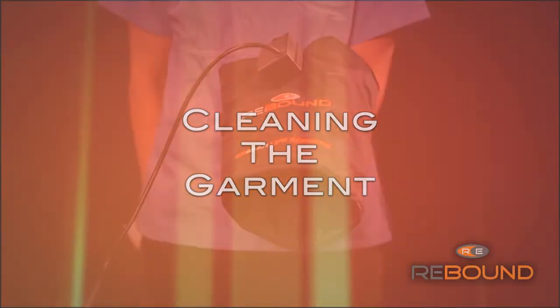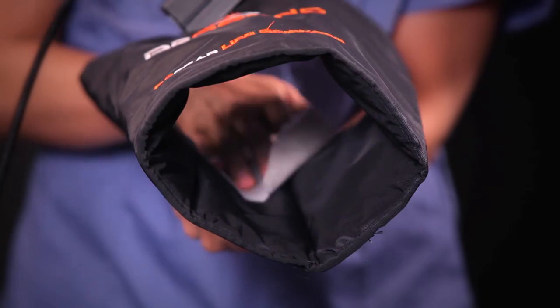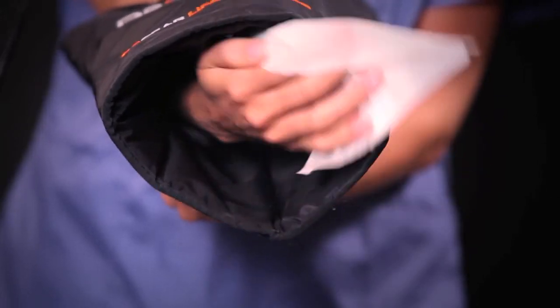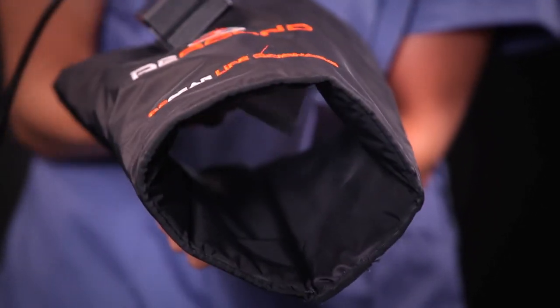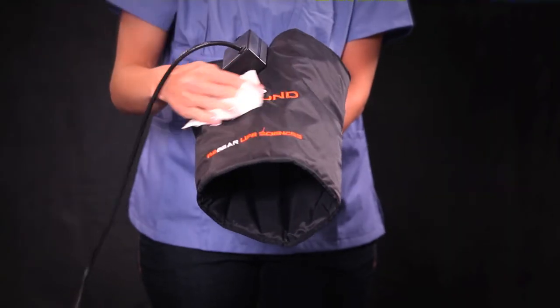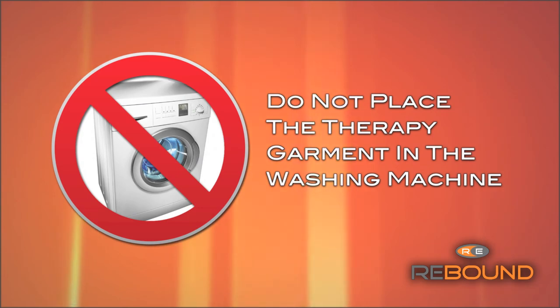Cleaning the garments — it is recommended to clean the therapy garments in between uses. Simply wipe down with an antibacterial wipe or spray. Additionally, the fabric contains an antimicrobial agent that helps to prevent the buildup of fungus or bacteria. Do not place the therapy garment in the washing machine.